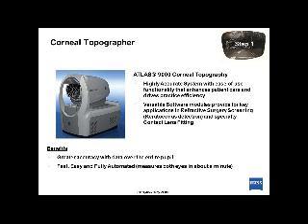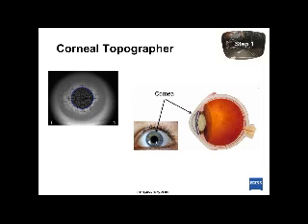This iProfiler also includes a Corneal Topographer, which is nice because then it's all done in the same refractive process, or the same pre-exam process. And corneal topography is measuring the topographical map of the cornea.